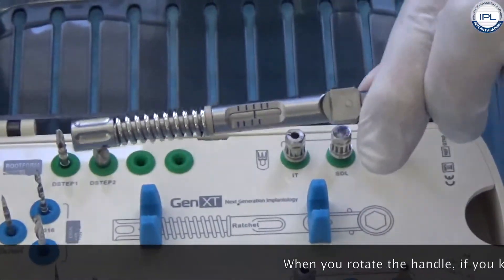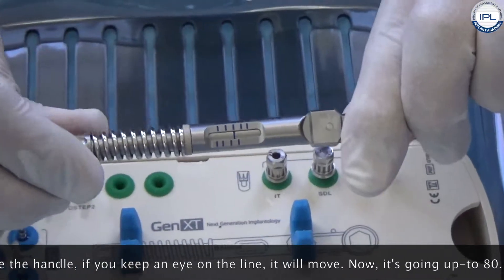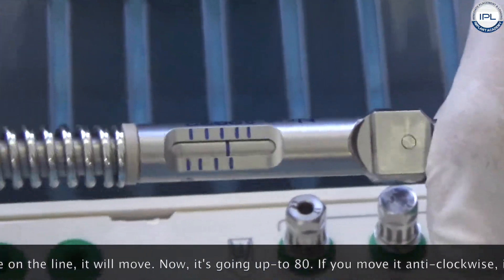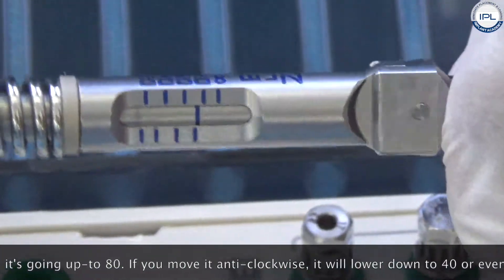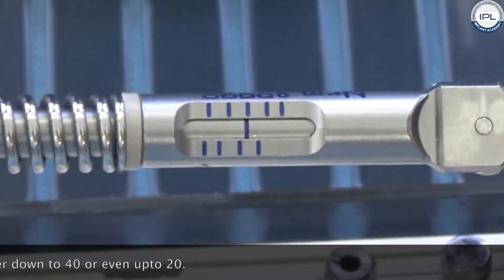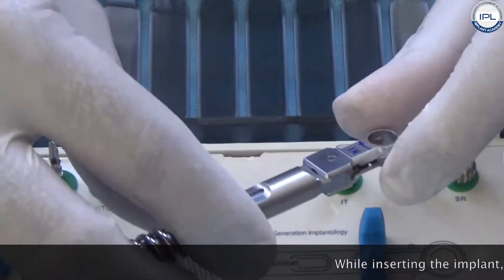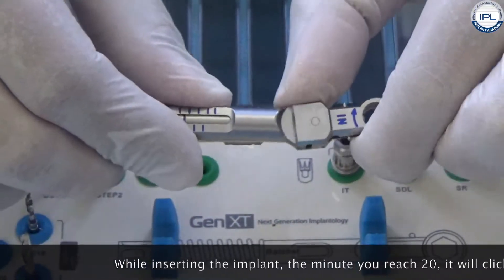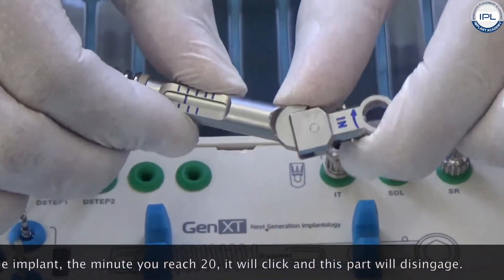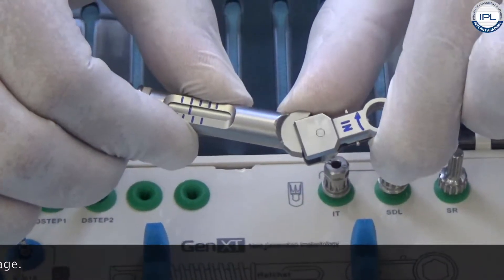When you rotate this, if you keep an eye on this line, it will move. You can see now it's going up to 80. If I move it the anti-clockwise way it will go lower down up to 40 and even up to 20. While inserting the implant, the minute you reach 20 you will have this clicking here. This part will disengage. So you know that you have reached 20.